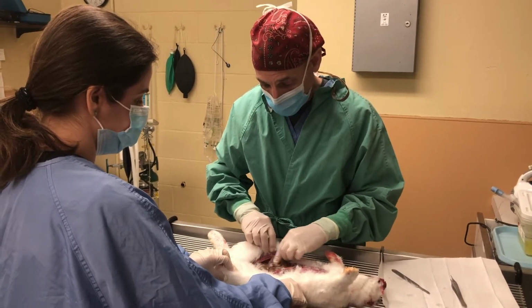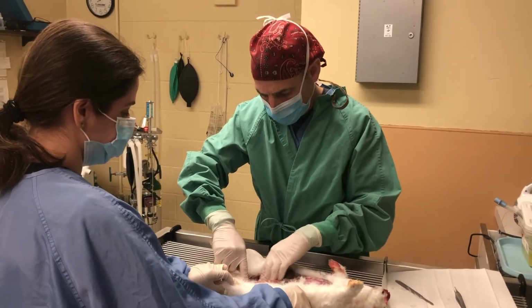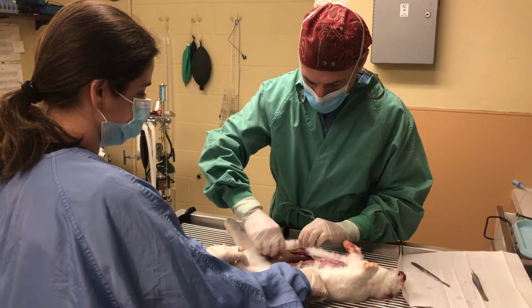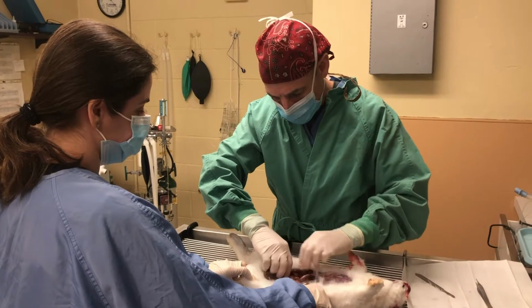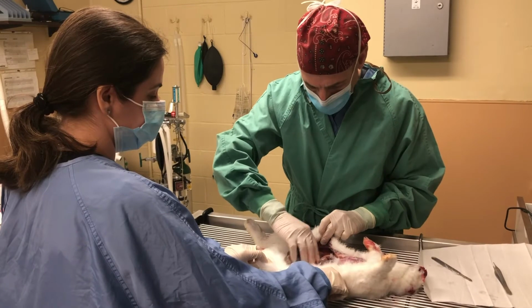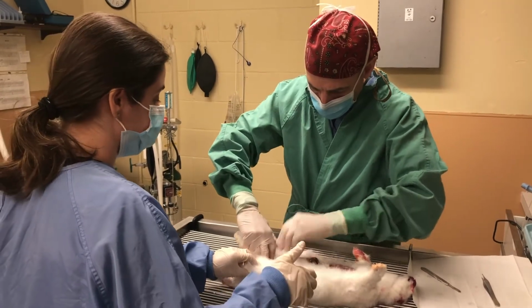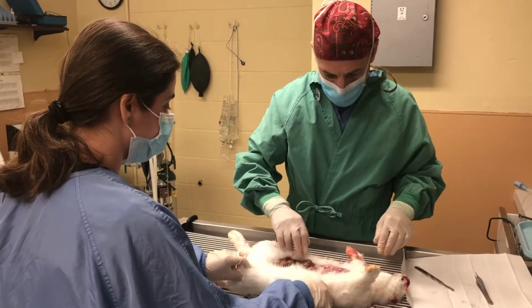So, looking just at the external organs, rather internal organs, intestines seem okay. We'll sample them just in case. Stomach looks fine. Kidneys look okay. It should also be noted that a lot of times after death there are changes to the organs, but they would all be considered post-mortem and not contributing to the death. Nothing else seems of excitement there.